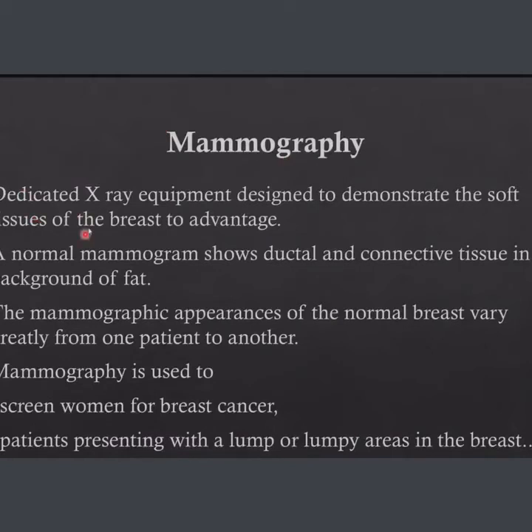So in the world we start with mammography for screening. Mammography uses dedicated X-ray equipment, and we have the CC and mediolateral views. It is used to screen women for breast cancer, and it is used also in diagnostic workup. What is diagnostic workup? A patient comes and says, I feel a lump. That is not screening. Screening means a patient who has no complaint comes just to check if she has cancer or not, because every woman is at high risk of breast cancer.